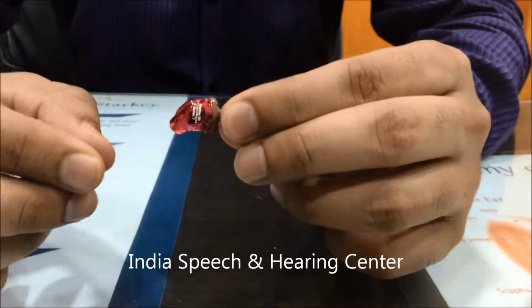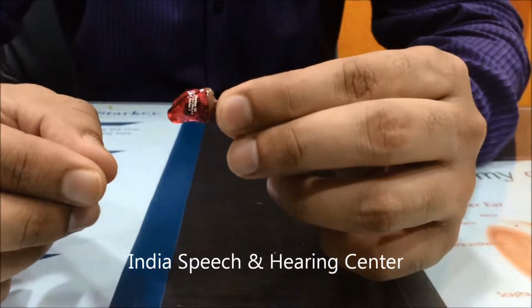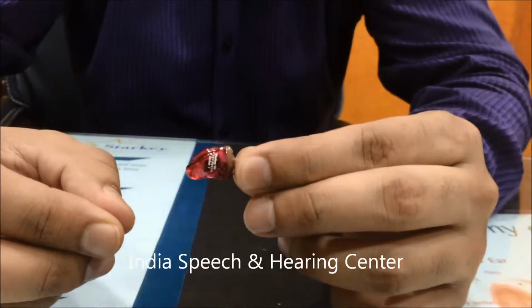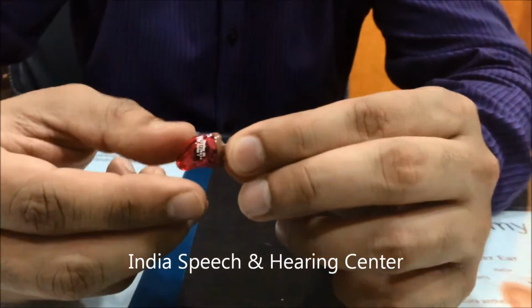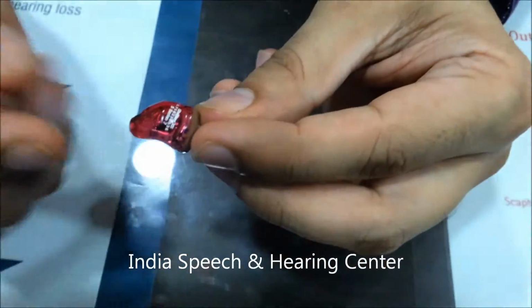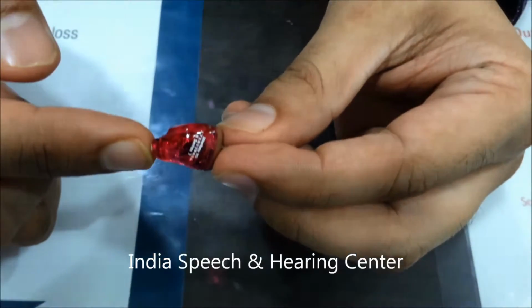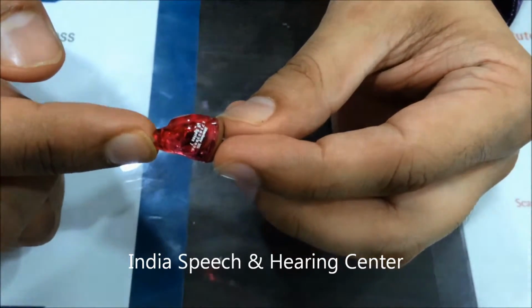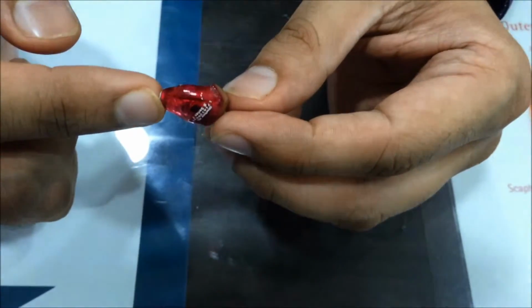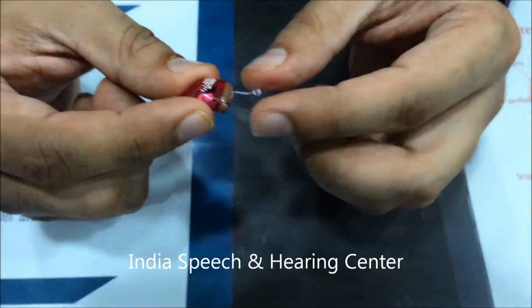This video will demonstrate the use, care and maintenance required for a CIC hearing aid. CIC hearing aid, also known as the completely in canal hearing aids. This is a typical CIC hearing aid that I'm holding. The outer part or the shell of the hearing aid is designed as per the specifications of the individual's ear canal. The hearing professional has to take a measurement of the ear canal, and this assembly is prepared.